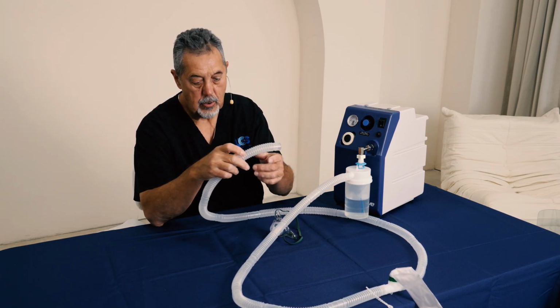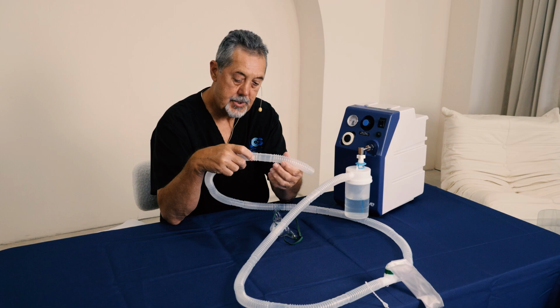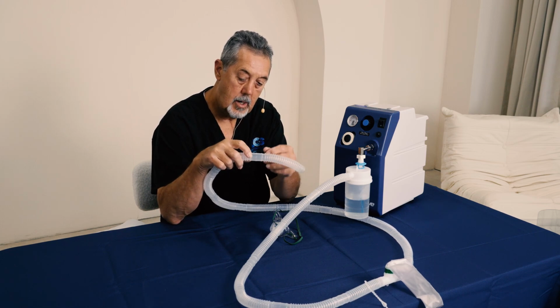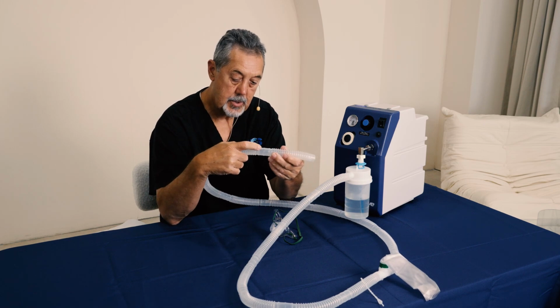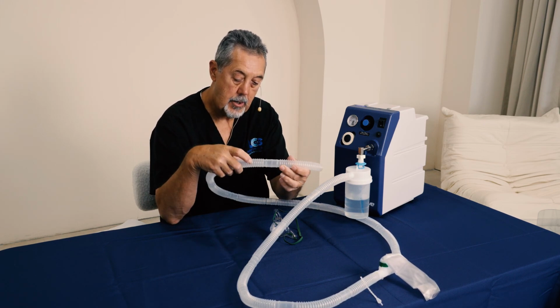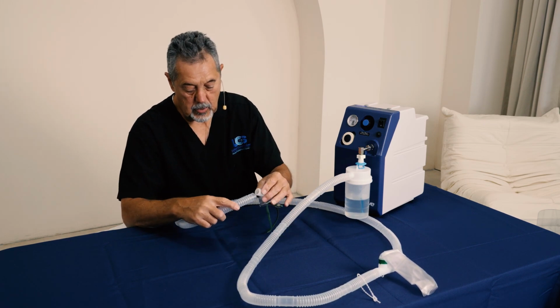When you go to cut your corrugated tubing, you want to place the scissors at the very middle of the connection between the 2 6-inch corrugated pieces. There's a little lip right here. You want to cut it right in the middle of that lip when you go cut new tubing.